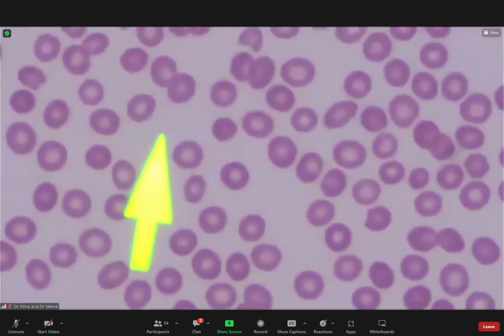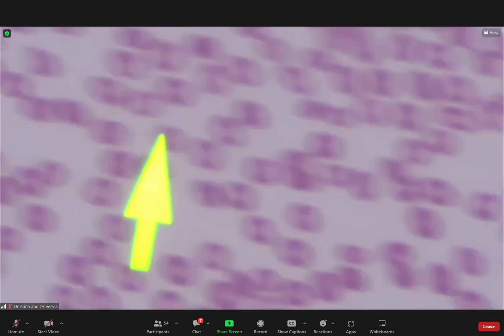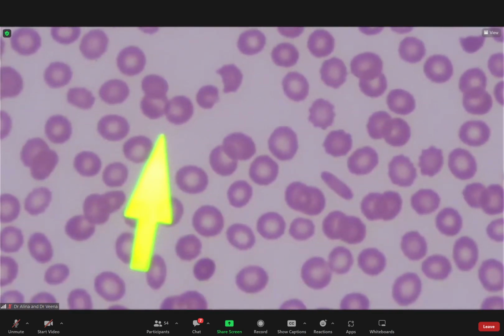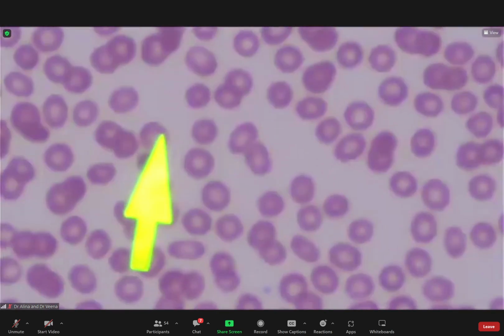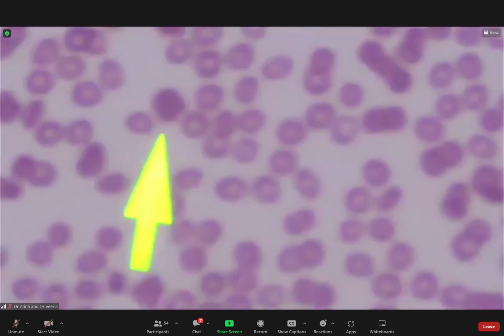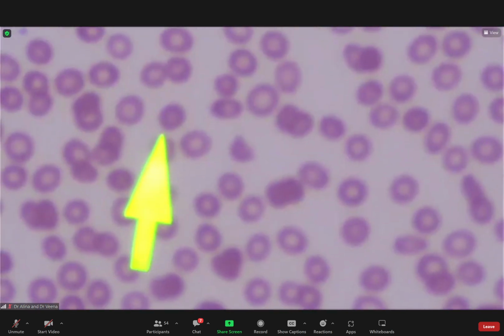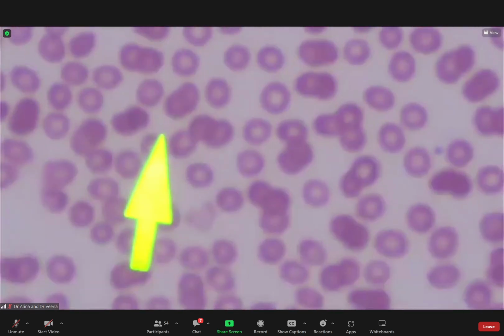So when we do malaria, I think the simplest one is usually falciparum. In falciparum, you would see the ring form is actually at the periphery. So that's the simplest. And vivax and ovale overlap a little because it usually affects the younger ones. So I think most times the gametocyte is the one that will give you an idea of the vivax.